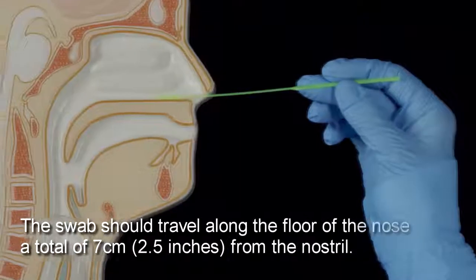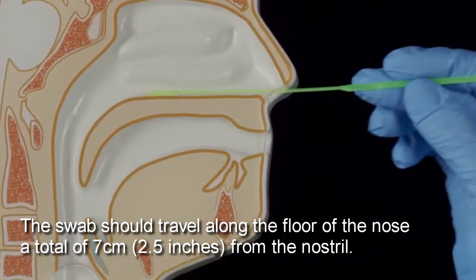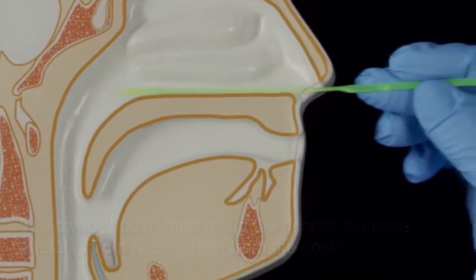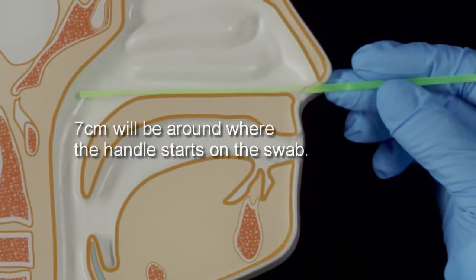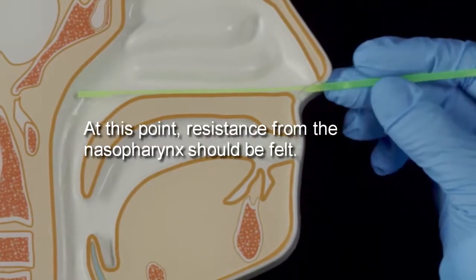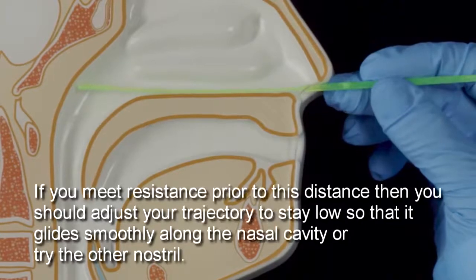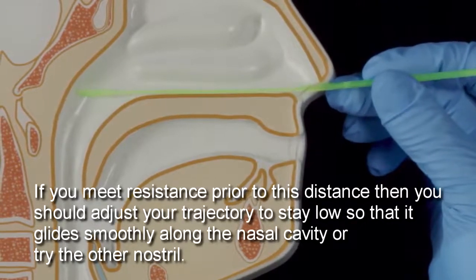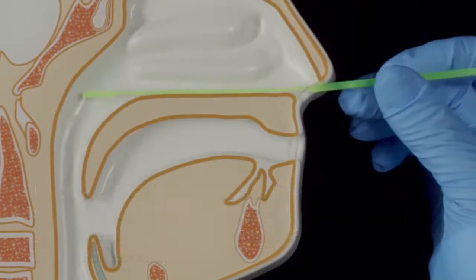The swab should travel along the floor of the nose a total of 7 centimeters, or 2.5 inches, from the nostril. Remember that 7 centimeters will be around where the handle starts on the swab. At this point, resistance from the nasopharynx should be felt. If you meet resistance prior to this distance, then you should adjust your trajectory to stay low so that it glides smoothly along the nasal cavity, or try the other nostril.